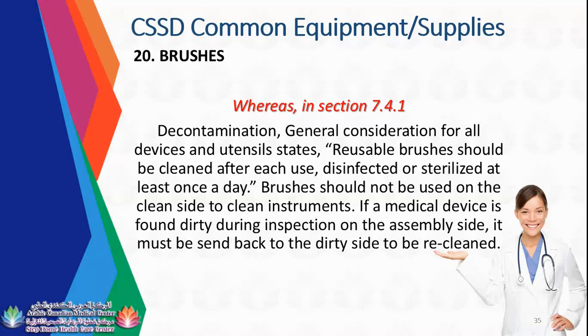Because sometimes, some CSSD technicians, once they are very busy, once they see just a small portion of blood, they have an intended brush in the inspection area, and then they will brush there, or they will just wipe it with disinfectant and then pouch. No, it's not allowed. You need to send it back to the CSSD decontamination area and do the manual brushing and put it back again in the ultrasonic machine.